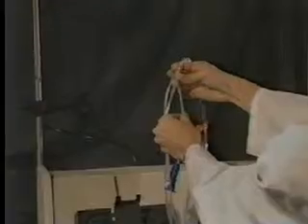Notice that the coil has 3 lines taped together with red tape. They are the red access line, the clear anticoagulant line, and the green saline line. Hang the access connection on the hook on the left side of the IV pole.